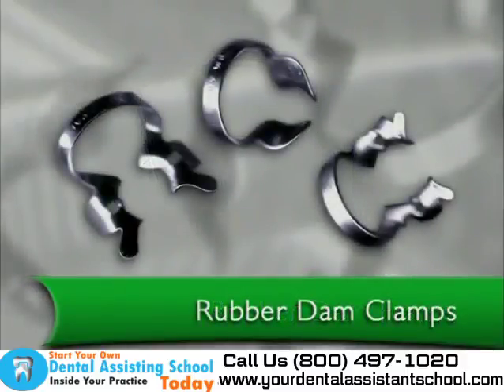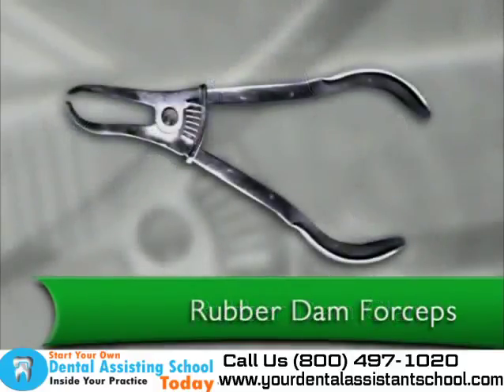Rubber dam clamps for stabilizing rubber dam material during the procedure. Clamps are winged or wingless depending on the tooth. Clamps may also be referred to as general purpose, which prevents gum intrusion, or high bow, which provides additional clearance at the crown of the tooth. Rubber dam forceps for placing and removing a rubber dam clamp.